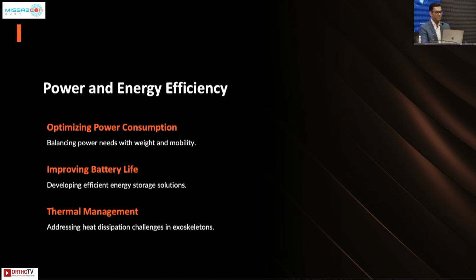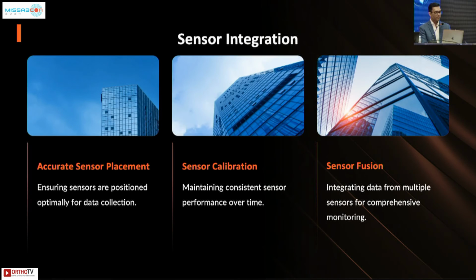Technological challenges are, the power consumption is the biggest technological challenge because the hydraulics consume a lot of energy, and so manufacturing them and to use them for 1 hour, you will drain the battery within 40 minutes to an hour. So you need high power, and we're working on those as well. How to improve the battery life.